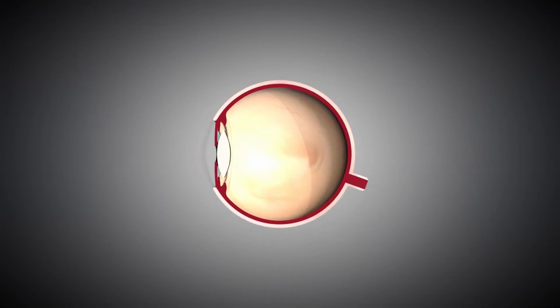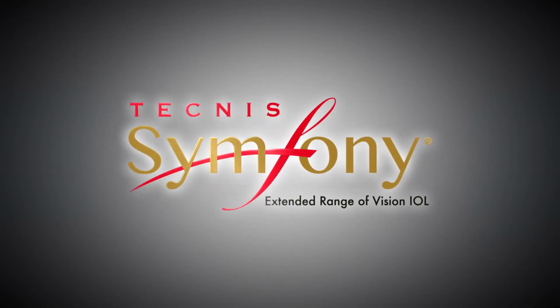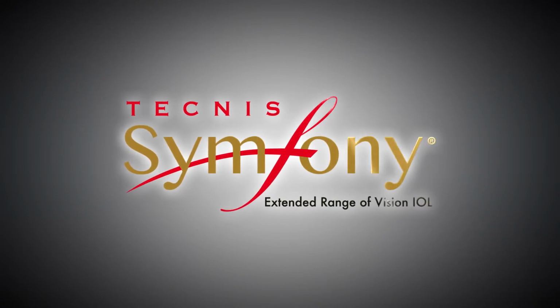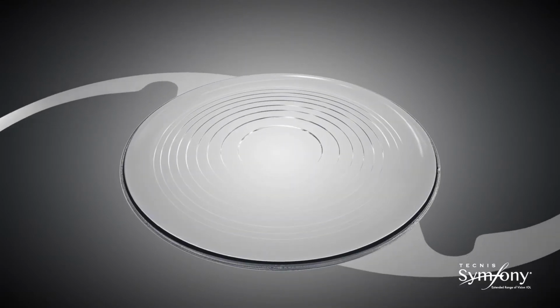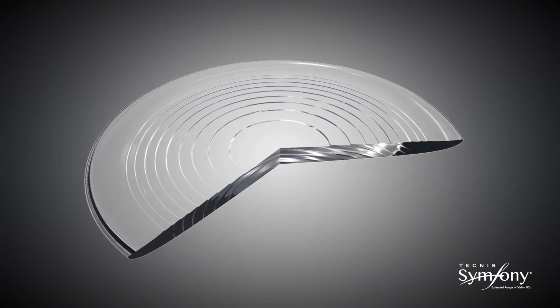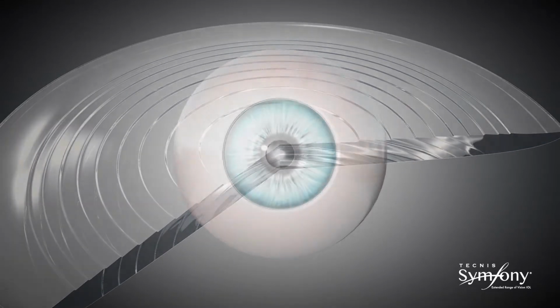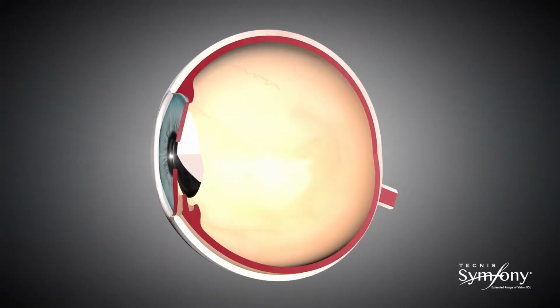Now, with the introduction of Tecnis Symfony Extended Range of Vision IOL, a new category of presbyopia-correcting IOLs is available for patients. Tecnis Symfony IOL is the first and only presbyopia-correcting IOL that provides an extended depth of focus, which results in an extended range of continuous, high-quality vision with enhanced image contrast, as well as low levels of visual disturbances.